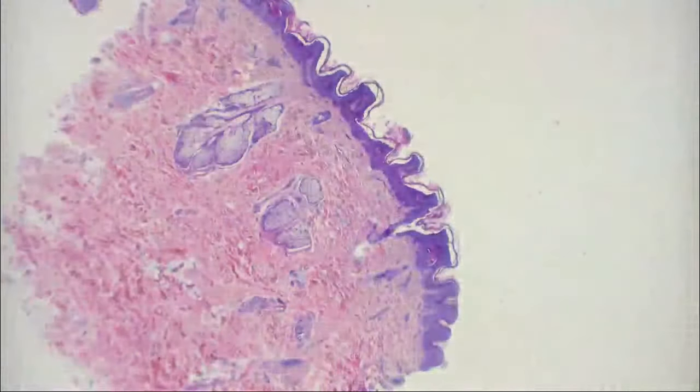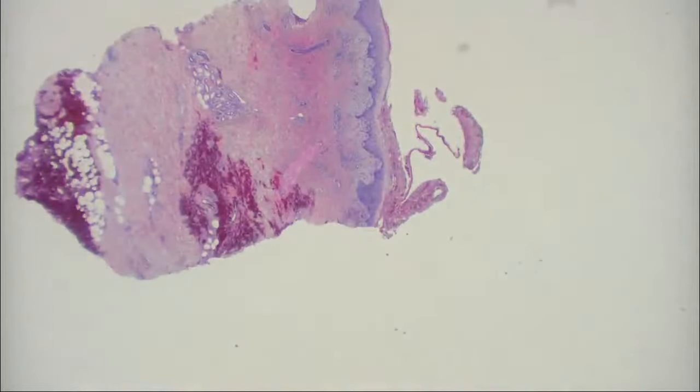What if we saw features that look like psoriasis? Can that be epidermal nevus? Of course it can be. So, you know, you can get ILVEN also. So there are a lot of different histologic patterns of epidermal nevus. Okay, this one is very nice. Some of these we could show at ASDP also.